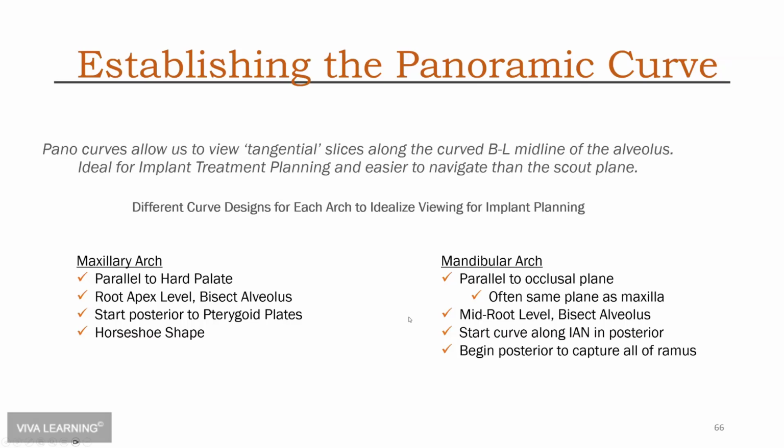Okay, now let's talk about the panoramic curve. So you've done your initial read. Whether you do this inside the room or not is up to you. Like I said, you could have your staff do this via AI anymore. So when you walk in, it's ready to go.